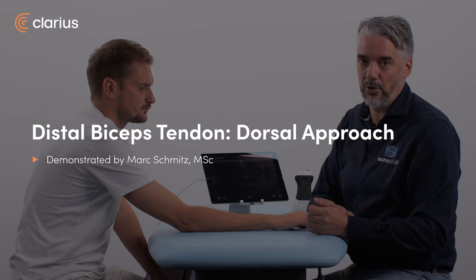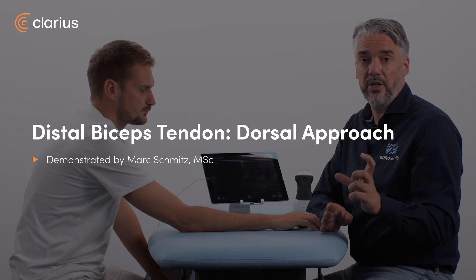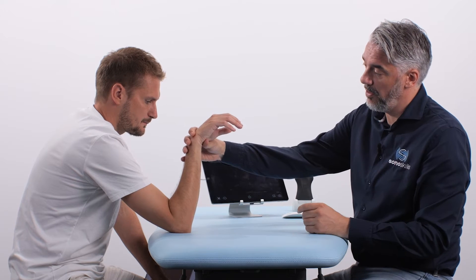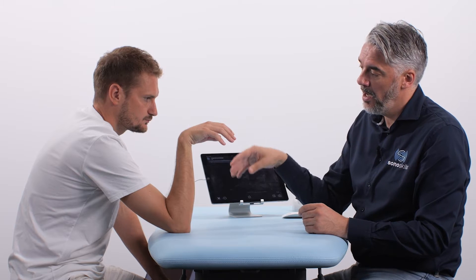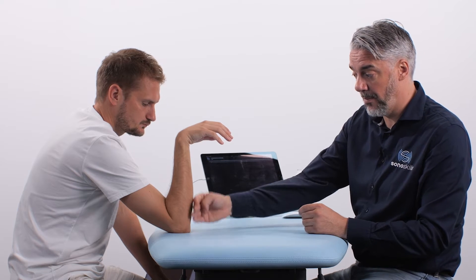The second approach is the dorsal approach, and the dorsal approach is my favorite because you can really see the insertion of the distal biceps tendon to the radial tuberosity. The patient position has a really cool name: the cobra position. The patient is seated on the other side of the table, leaning on the olecranon and placing the hand in pronation. This opens up the dorsal part of the arm so you can really see the insertion of the distal biceps tendon.